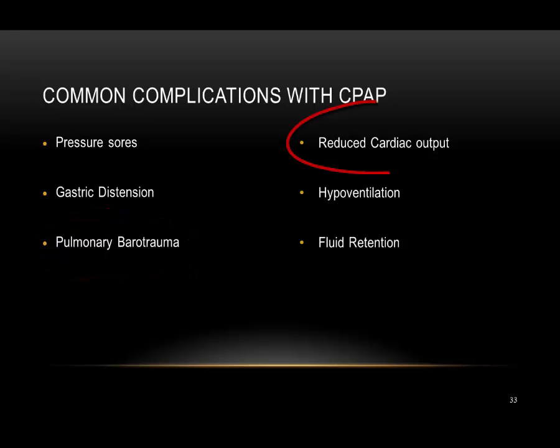Reduced cardiac output. Positive pressure therapy has been associated with a decrease in cardiac output. However, hemodynamic instability in patients treated with the levels of CPAP described in the report was most often due to hypovolemia. In Branson's report, cardiovascular depression did not occur in patients with adequate volume status.